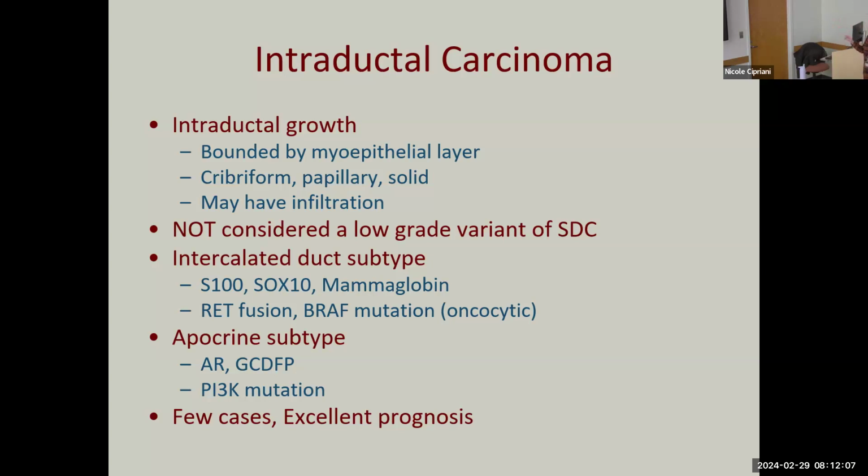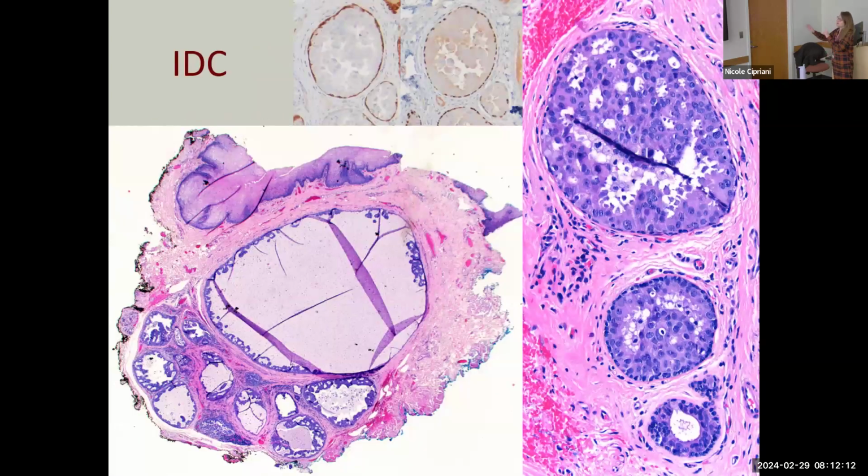We now call it intraductal, because these are actually bounded by P63 positive myoepithelial cell layers. They have similar cribriform spaces, these lumina, and this micropapillary-like proliferation into the architecture. But when you do your myoepithelial or basal cell marker, right, you'll see that it's actually intraductal. And here you can even see that on H&E.